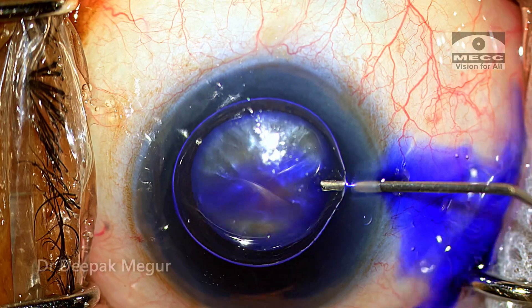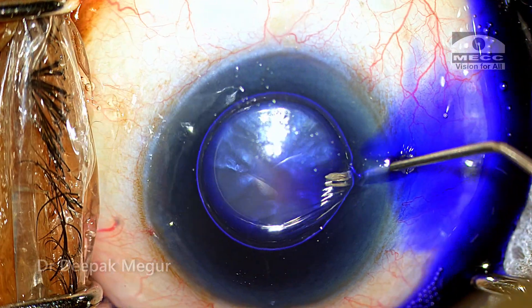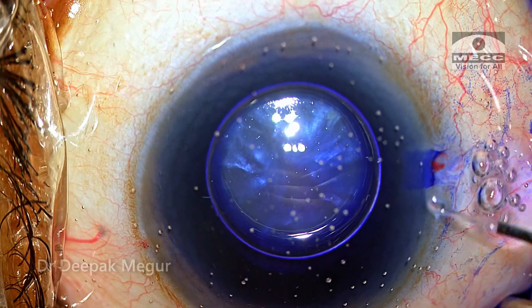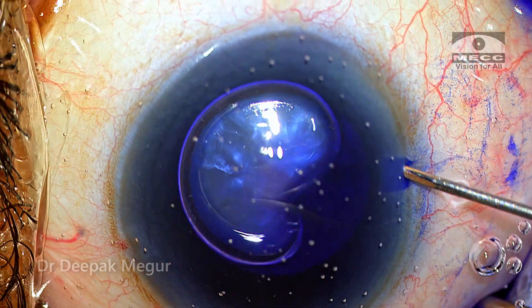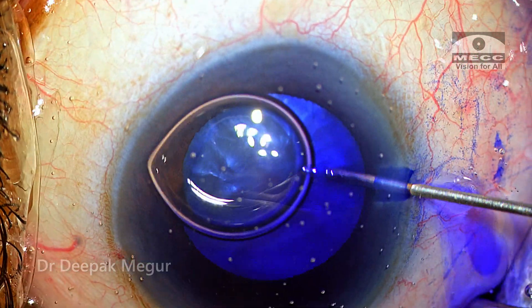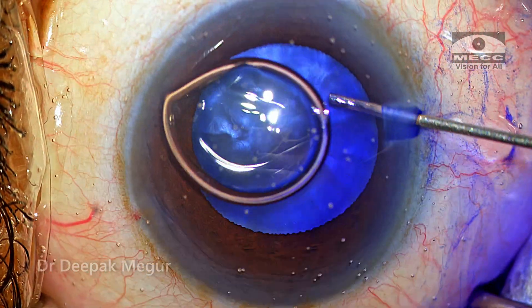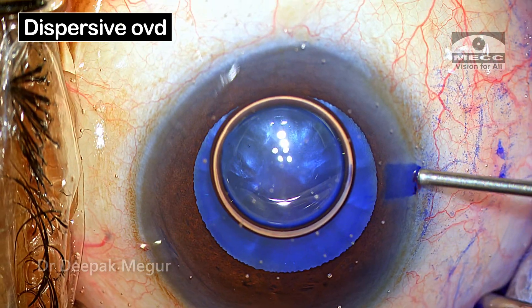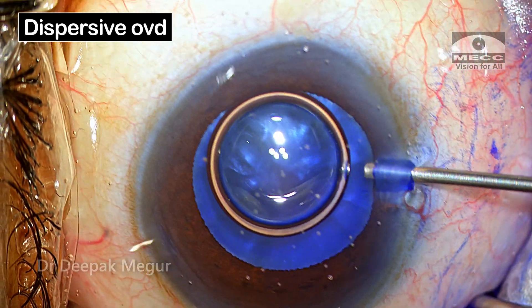Under the cover of air, I'm going to put in my dye — trypan blue — for staining the anterior capsule. The anterior chamber is then pressurized with dispersive OVD.